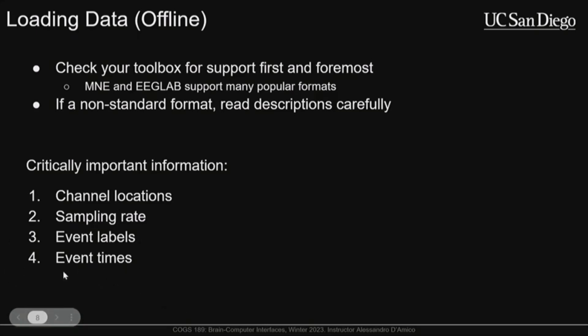And typically, this is going to be synchronized with your EEG time events, or you should do everything you can to get them synchronized, because you want to make sure that you're looking at the data as close as possible to when the event actually occurred most of the time. Or you want to be off by a certain distance. So maybe you want to look 300 milliseconds after a stimulus occurred or a response occurred. But you need to know precisely when that happened in order to do that accurately.